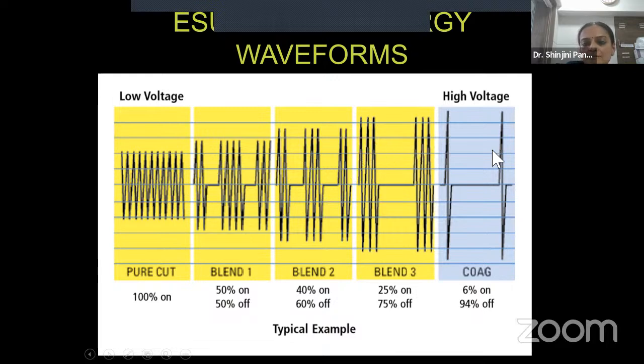However, if I'm using the blue pedal and I've set the same wattage, like 100 watts, but this you have to understand, this is off for maximum part of the time cycle. This current is on only for a minimum part, maybe 1 second. So in order to reach 100, the voltage has to spike to 100 into 1 equal to 100. Vis-a-vis here, 10 into 10 equals 100.